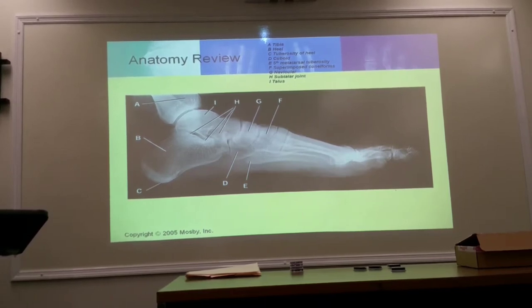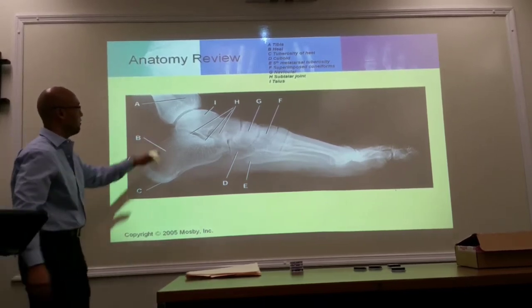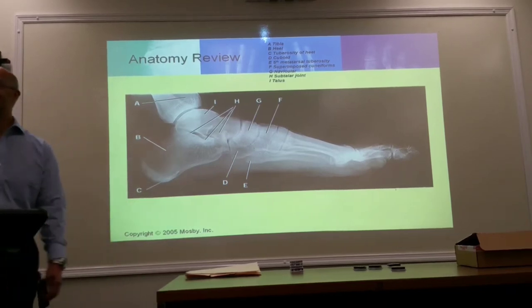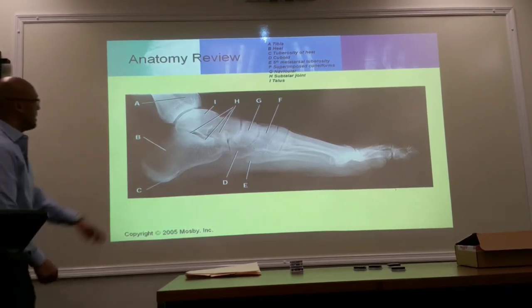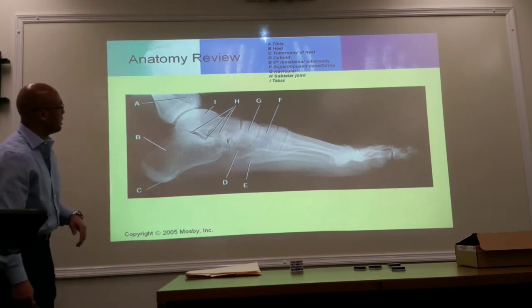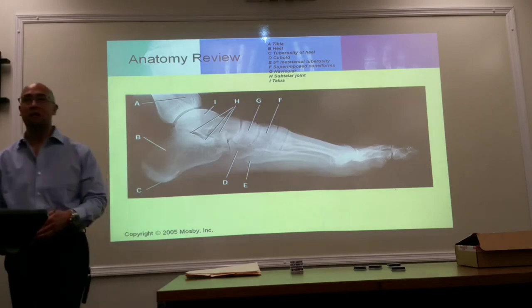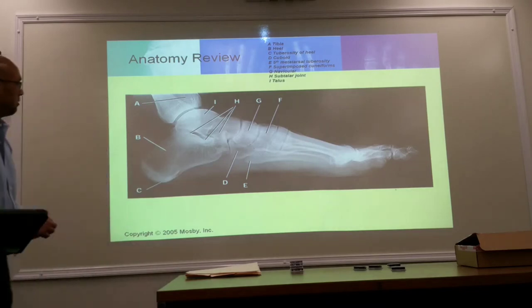So, what is A? It's a tibia. B, calcaneus. The joint space between, that's H, is going to be your joint space. Now we're talking about your articulation between those two bones.